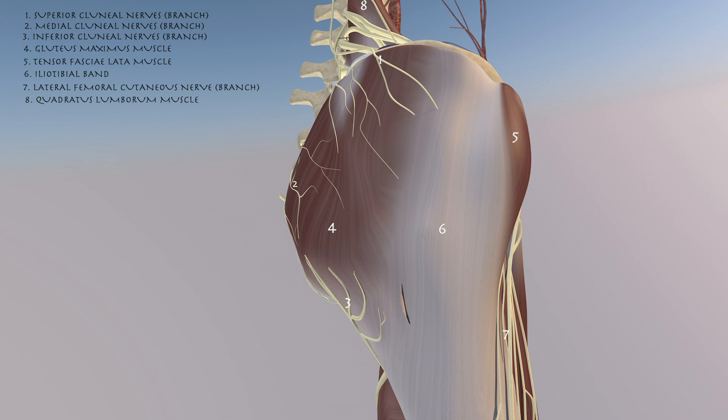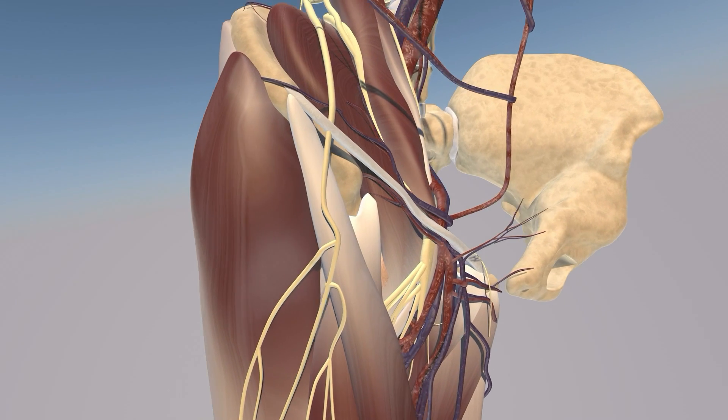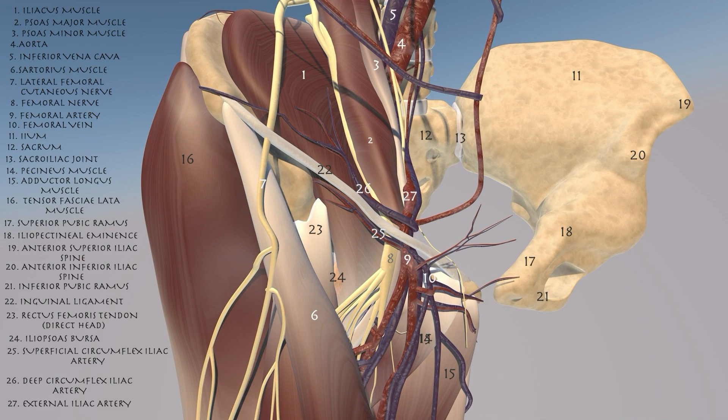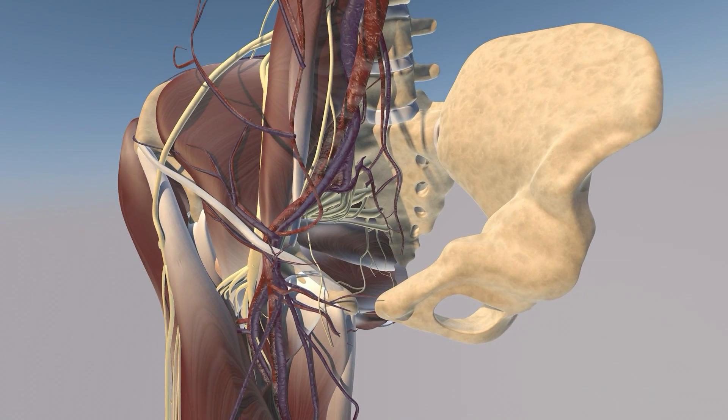Here we're going to view some of the anatomy over the lateral hip and pelvis. There's a little bit of a technical glitch over the proximal ITB, which I apologize for, but you can appreciate here the ITB and tensor fasciae latae muscle. You can also appreciate this intricate neurovascular network consisting of the femoral artery, nerve, and vein feeding the thigh.